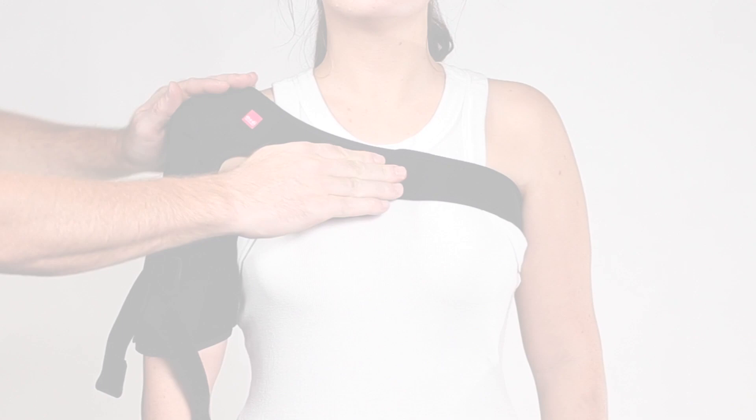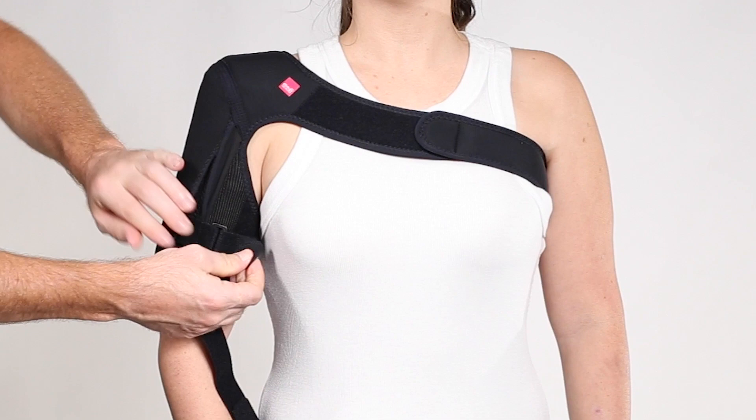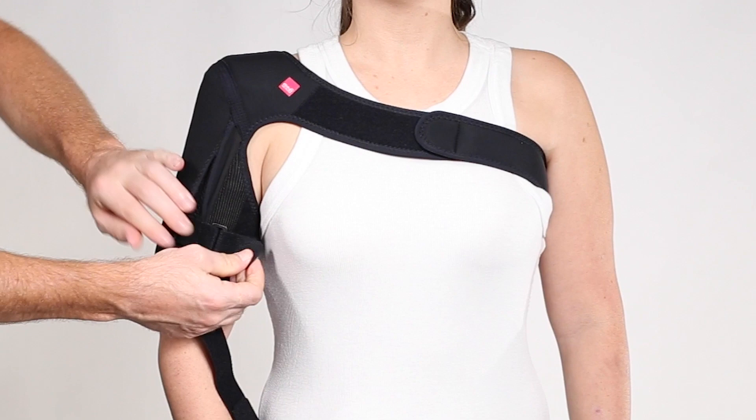Secure the wrap closures around the arm. There are four closures included with the brace. Depending on patient need, two, three, or four can be used. If you are not using all the straps or need to reposition any of the straps, pull open the cover panel and adjust the straps as needed.